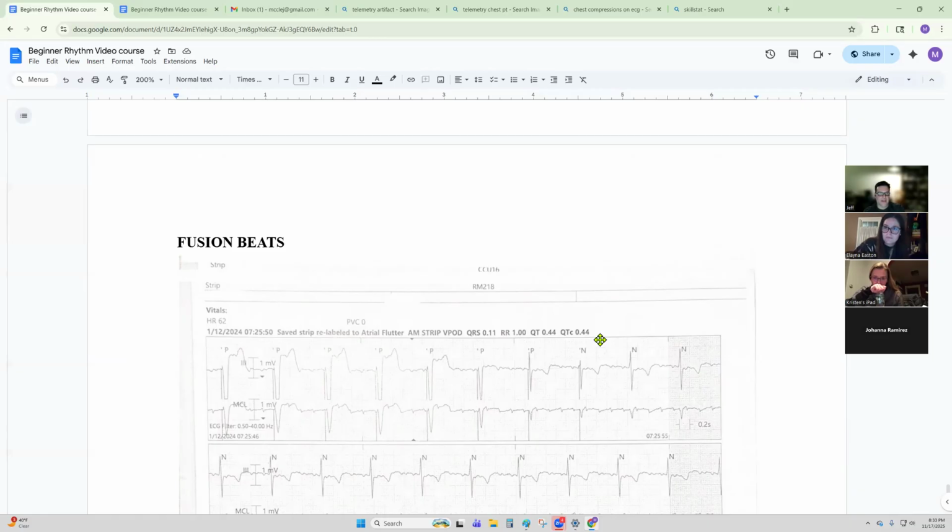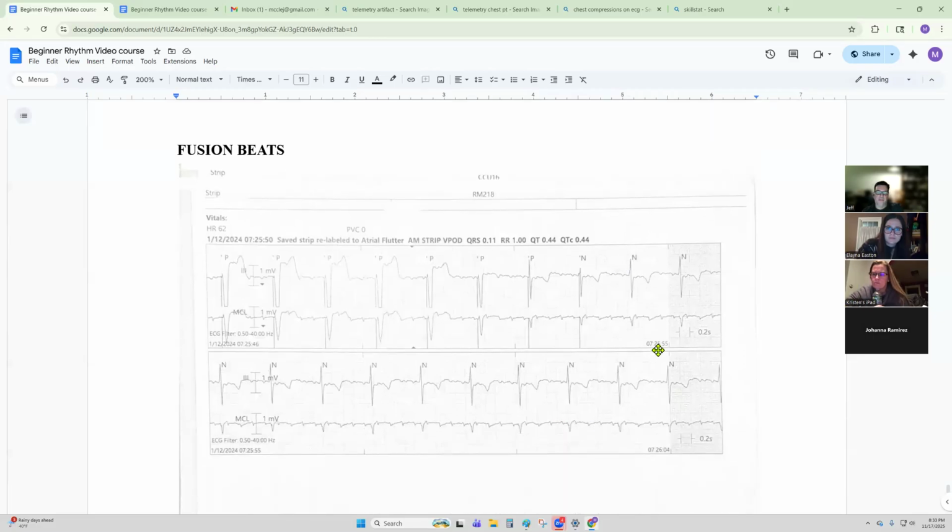I'd have to see it. It's all about timing too. It's waiting for AV delays or activity to happen, and then it waits this milliseconds before something else happens. It could just be bad timing. I'd have to see it. Yeah. But to her point, fusion beats.